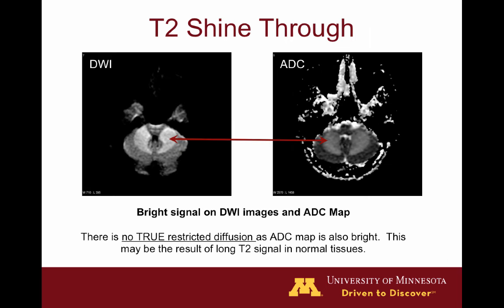Here we have an example of T2 shine-through. We've got DWI and ADC images of the posterior fossa, and you can see increased signal on the diffusion-weighted images and also increased signal on the ADC map, predominantly in the white matter of the cerebellum. So this is not really restricted diffusion — this is T2 shine-through.